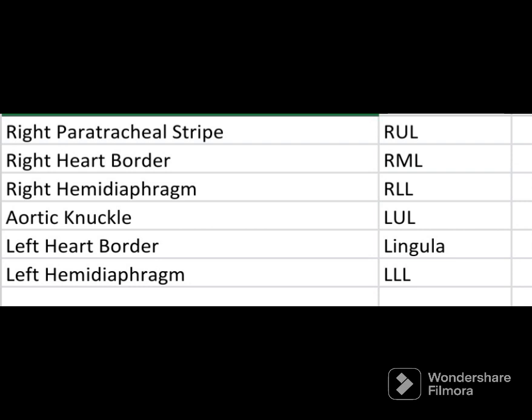Similarly for the left side: the aortic knuckle corresponds to the left upper lobe, the left heart border corresponds to the lingula, and the left hemidiaphragm corresponds to the left lower lobe.